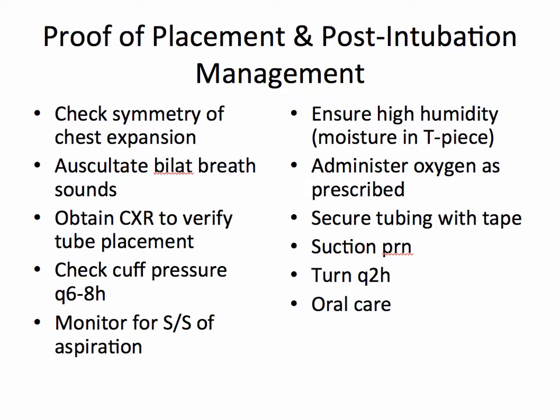monitoring for signs and symptoms of aspiration, ensuring a high degree of humidity, which can be noted as moisture in the T-piece, administration of oxygen as prescribed, securing the tubing with tape, suctioning as needed, turning the patient every 2 hours, and oral care. Monitoring cuff pressure, maintaining humidity, and titrating ventilator settings all fall within the scope of practice of the respiratory therapist, although in some areas, the RN is primarily responsible for these tasks.